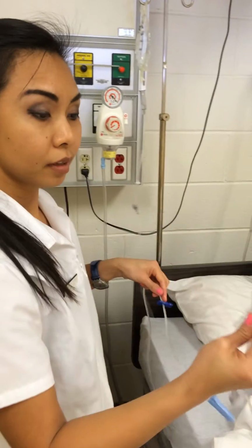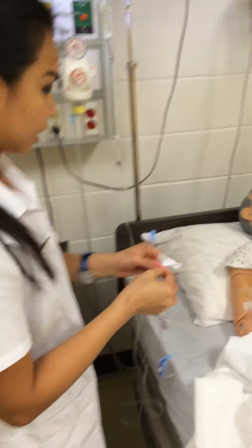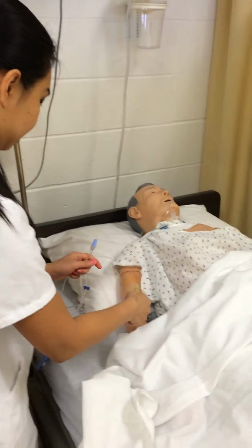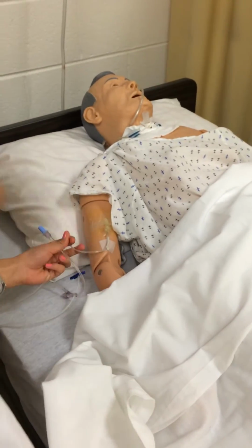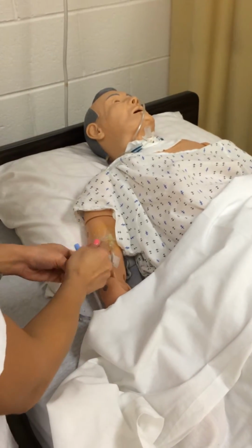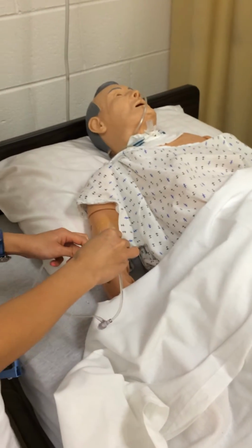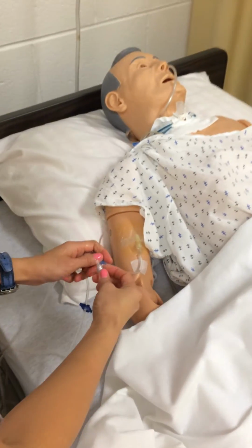Before I give the IV to the patient, I make sure I clean the site first, the heparin lock. Clean. I open it and I connect the IV to the heparin lock.